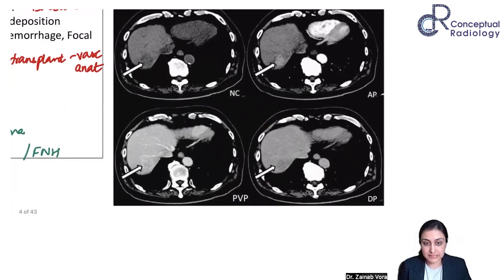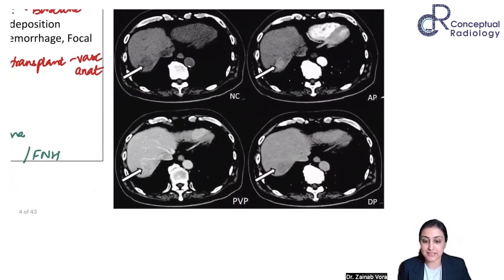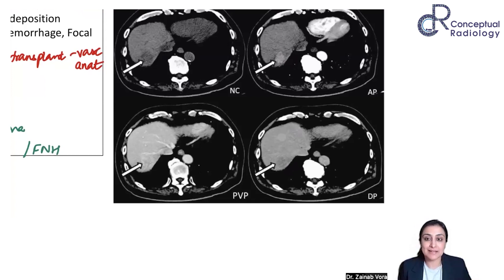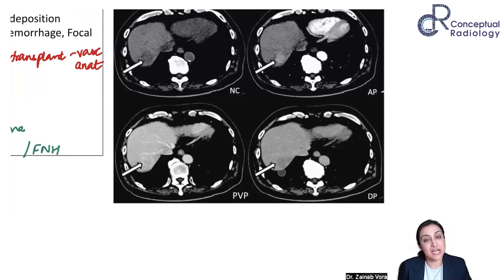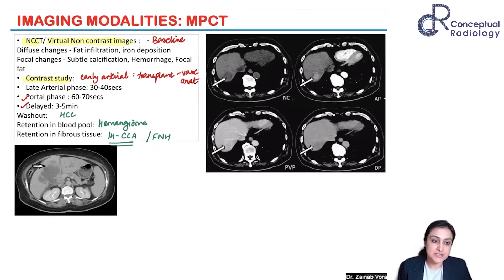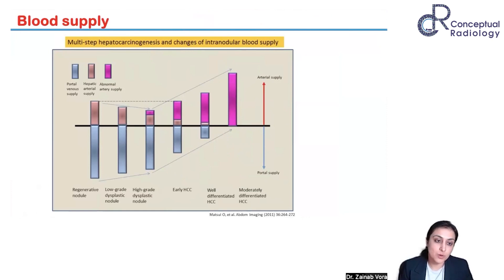In this HCC case: non-contrast hypodense, early arterial enhancement, and then washout in the delayed phase. An important clarification for juniors: washout is NOT compared to the arterial phase — it's compared to the liver parenchyma. The mass becomes hypodense compared to background liver parenchyma. That is washout. This is a typical scan of HCC. We will study this in detail — this was just to give you an idea.